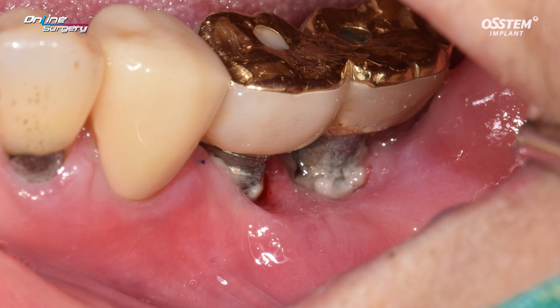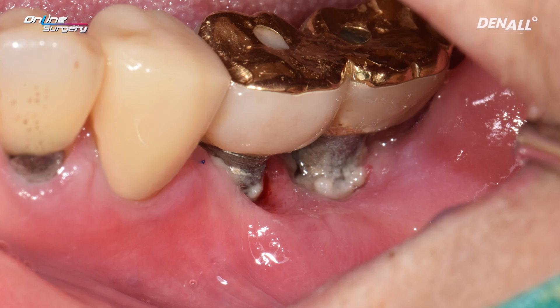Looking at the oral photo, the soft tissue contour is not very good. It's unclear whether it was like that from the beginning or due to the peri-implantitis. Either way, soft tissue contour is poor, so soft tissue improvement needs to be included in the plan.